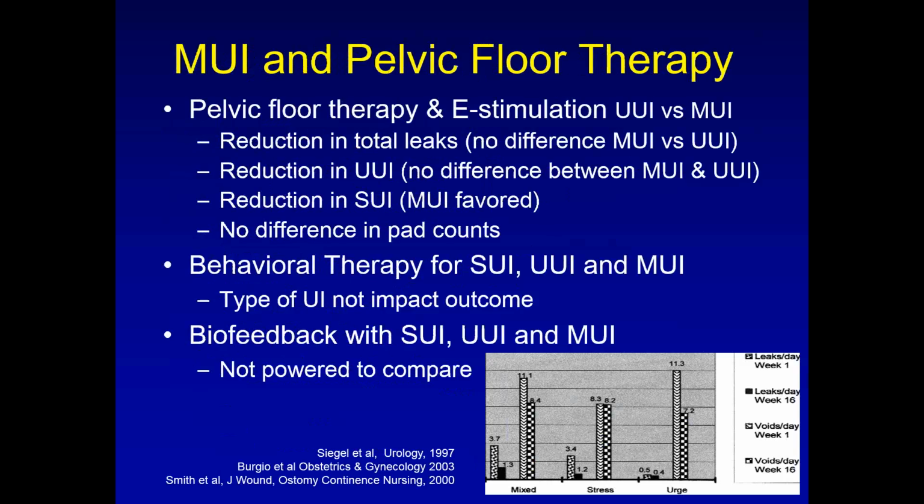For pelvic floor therapy, looking at different forms of pelvic floor therapy, urodynamics again really didn't play a role here. Now, if you think about where you will insert pelvic floor therapy in your armamentarium, it's going to be a first-line therapy, most likely. So urodynamics doesn't usually come into this picture anyway. It's not like you're going to say, oh, I did my urodynamic study, I saw mixed incontinence with overactivity and stress incontinence, so I'm not going to offer you pelvic floor therapy. That's not what we use urodynamics for.